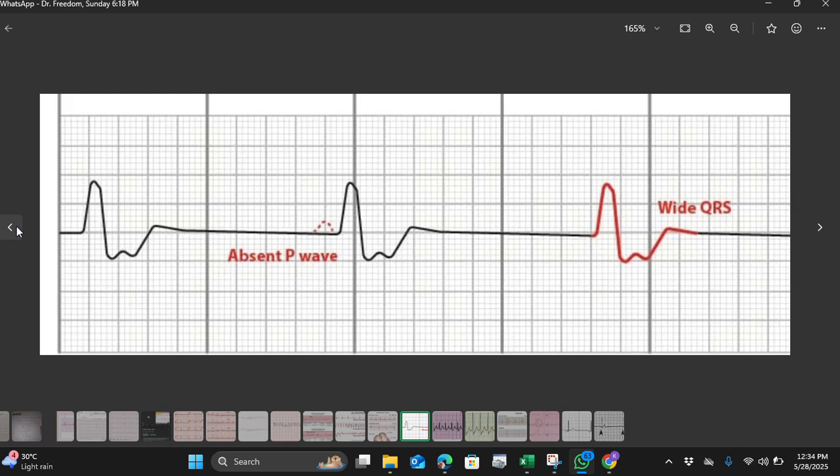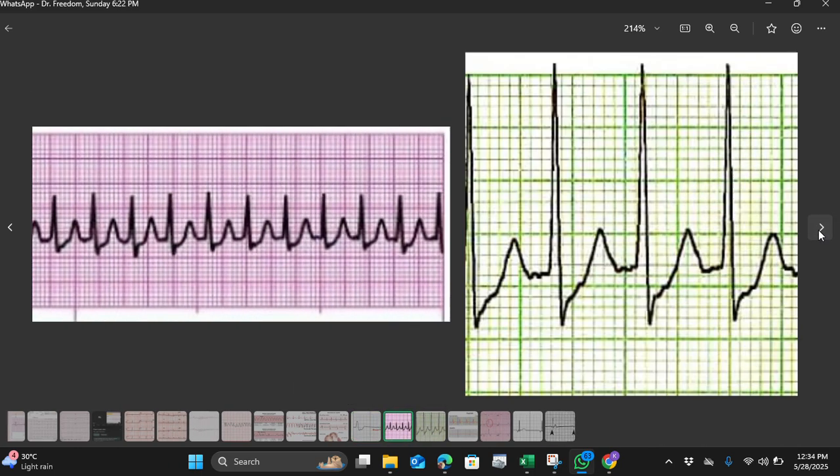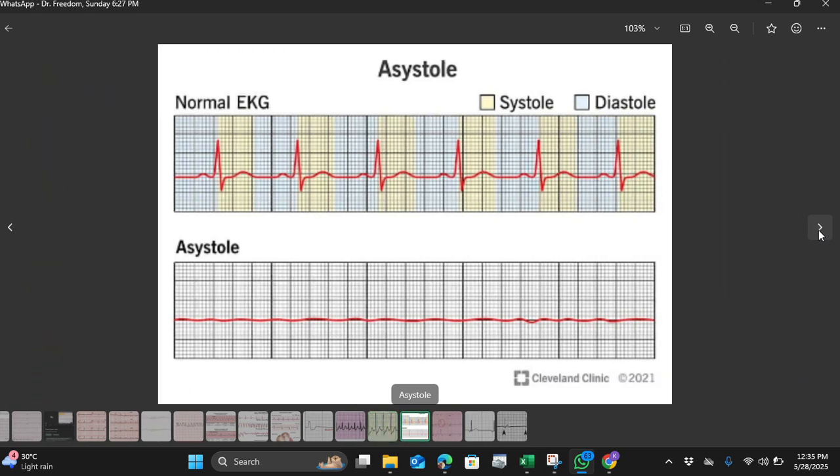What is happening there? The AV node is dead, the beat is coming from the ventricle, which is taking over the electrical activity of the heart. Now look at where our problem is coming from. That's why I'm telling you to know the meaning, because that's when you know where to look.